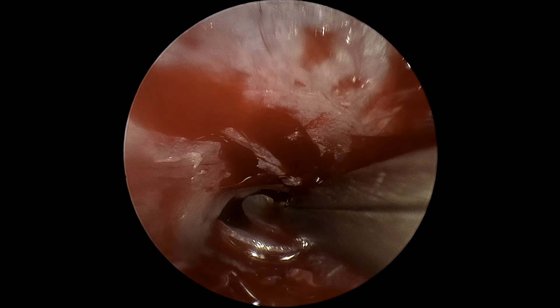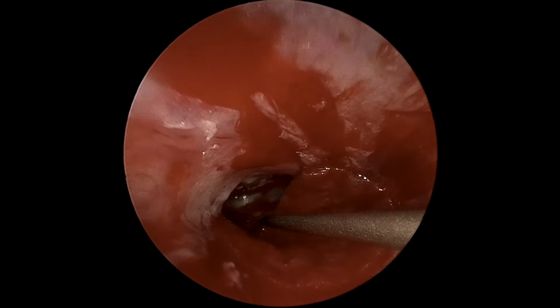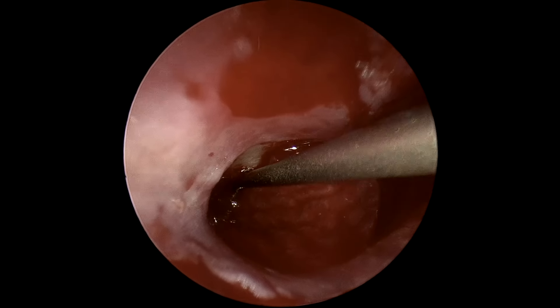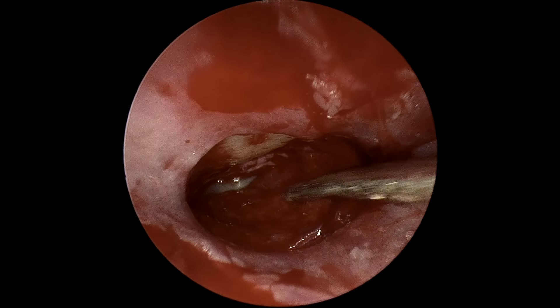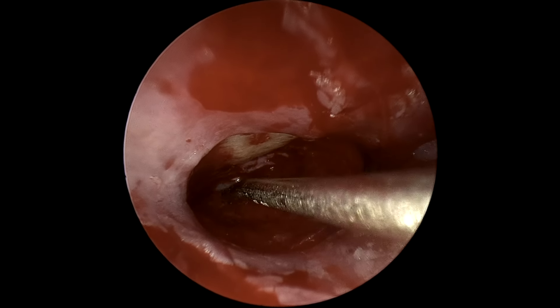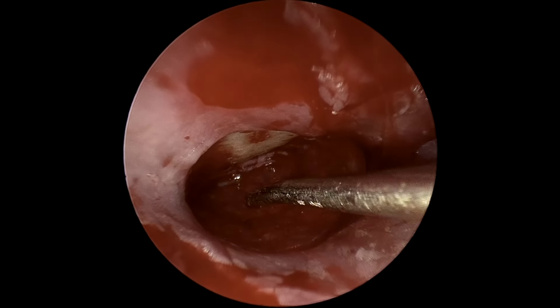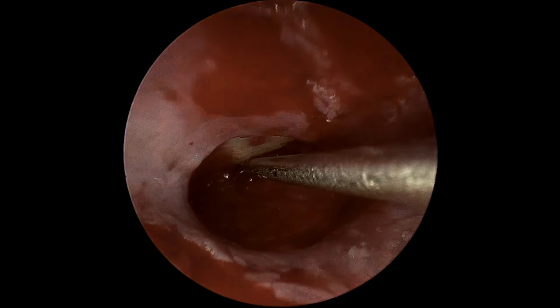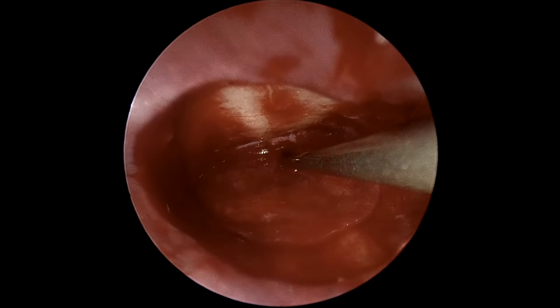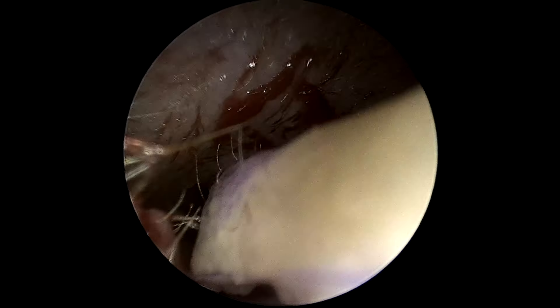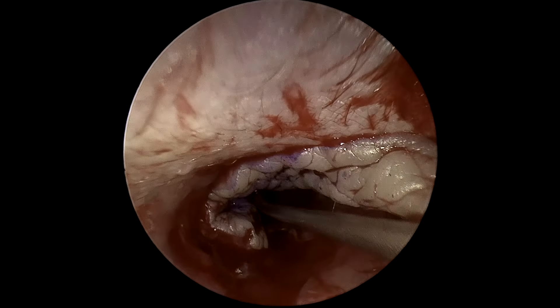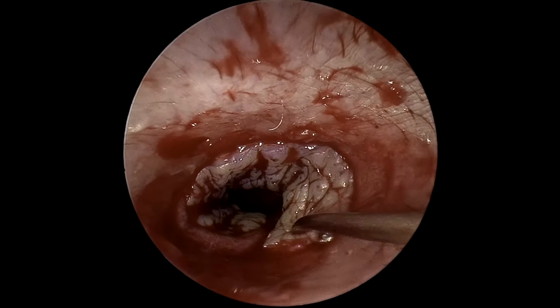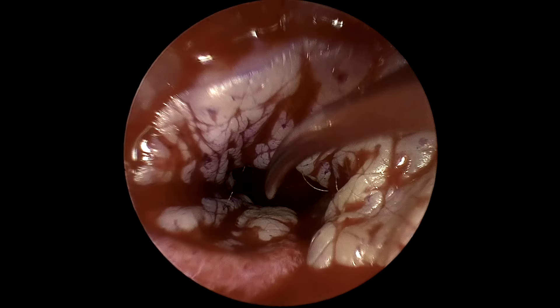Our graft is then brought into the field and slid in under the anterior lip. A posterior skin graft is then brought into the field, placed circumferentially in the canal, relining the exposed bone, and with slight overlap on our graft.